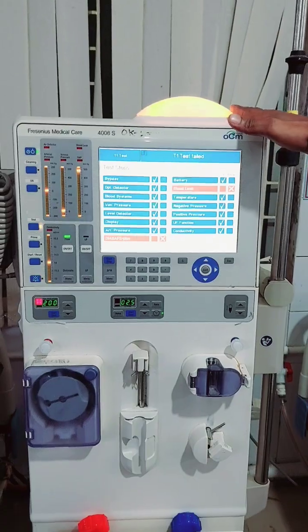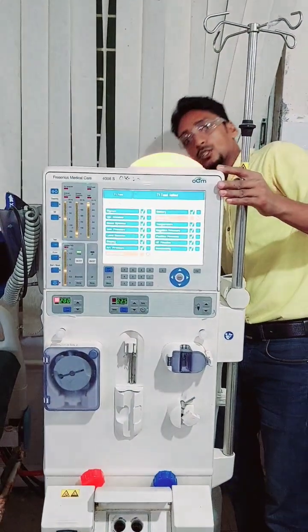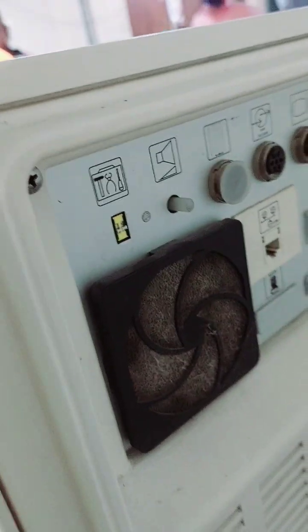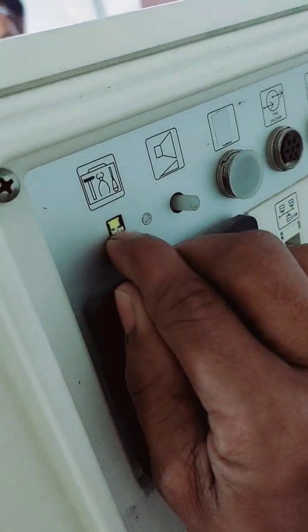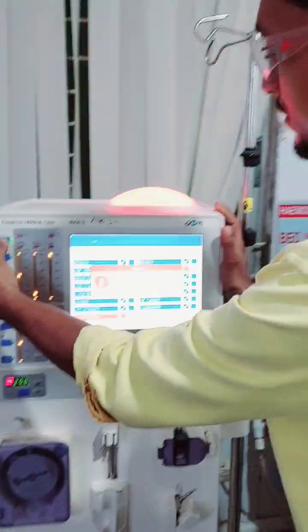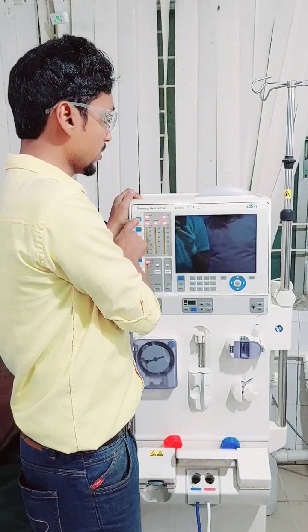First, I turn on the heater relay. The machine turns off — the light — and then turns on.